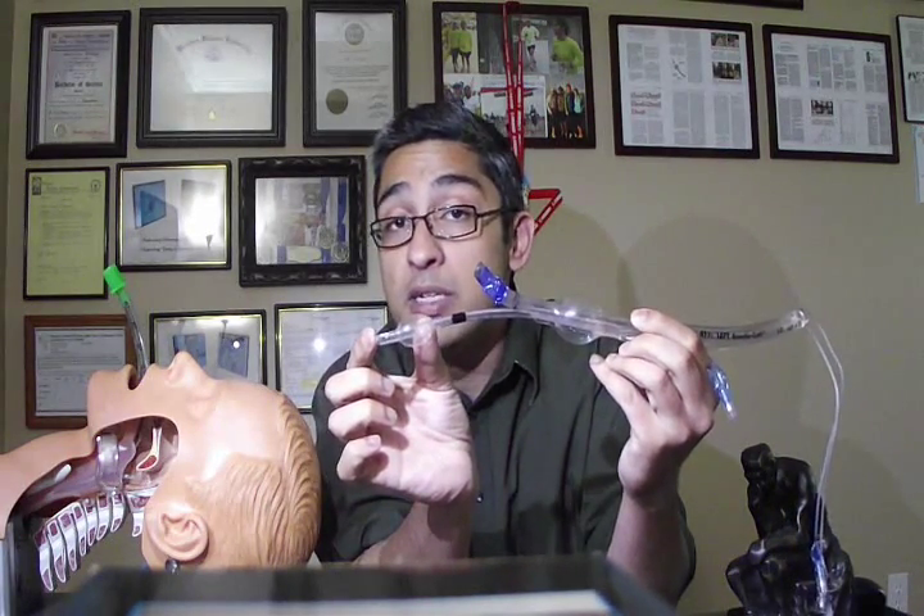Once I have put in the needle, placed the guide wire, completed my dilatation and am just about to place the tracheostomy tube, this tube would need to be pulled back. By making the shorter length just 2 centimeters, it will be possible to remove this ventilator tube and push in the tracheostomy tube without any problems. I wanted to maintain 100% bronchoscopic visualization throughout the procedure, and by making these two tubes mobile relative to each other, the viewing tube does not have to move even 1 centimeter, and you always get an awesome view of the operating field — the anterior tracheal wall from below.